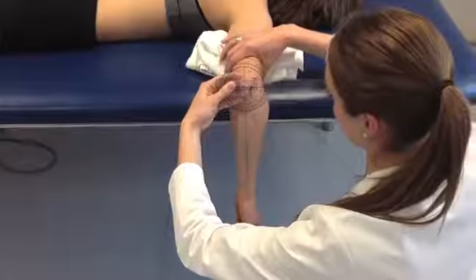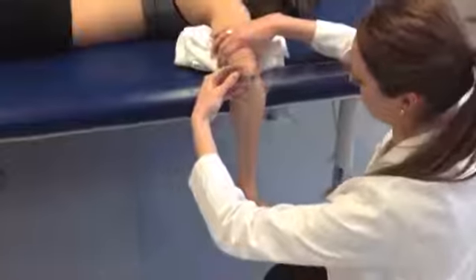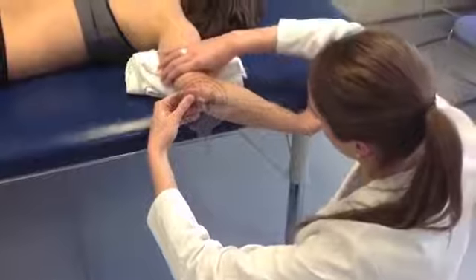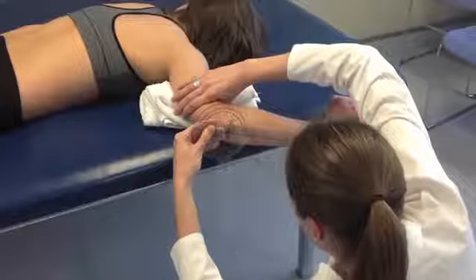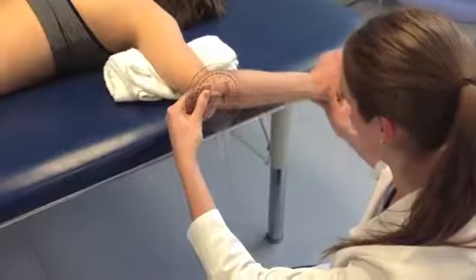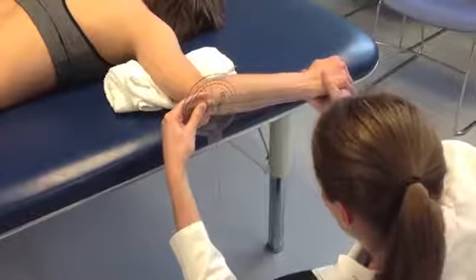The therapist should measure active range of motion, followed by passive range of motion. Okay, Kat, I'm going to ask you one more time to lift the top of your hand up to the ceiling for me. Is that as high as you can go? Yep. Okay, now come back down. Relax. Now I'm going to bring your hand back up. Okay, relax.